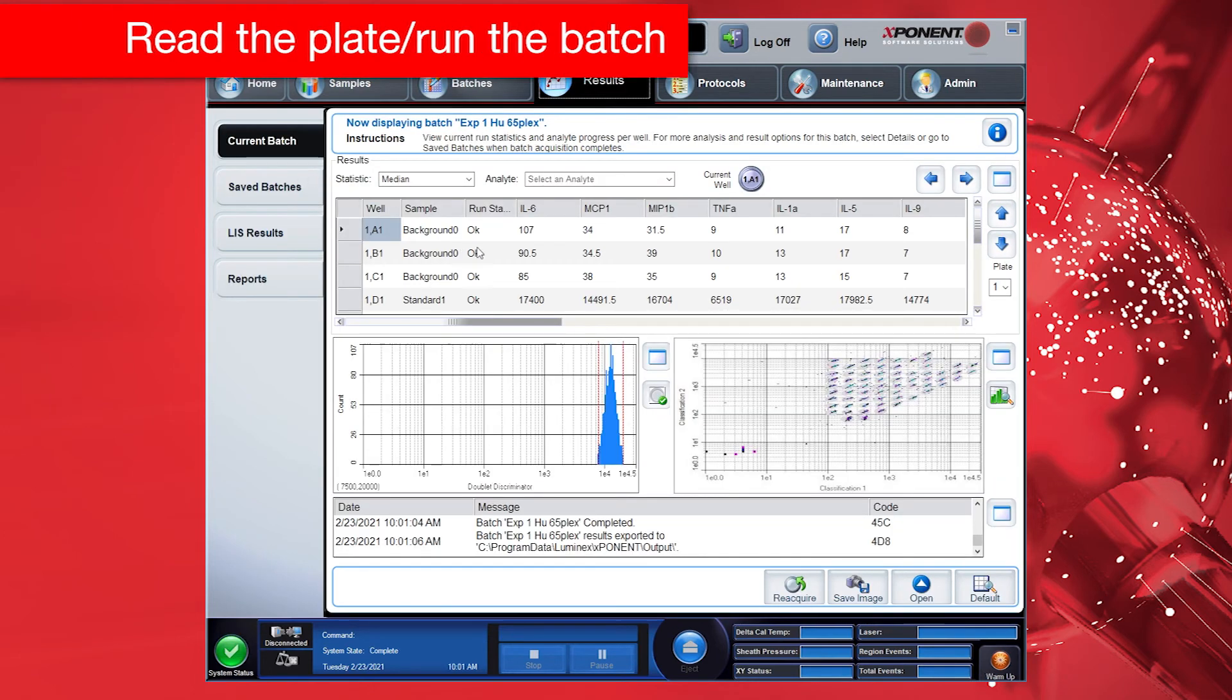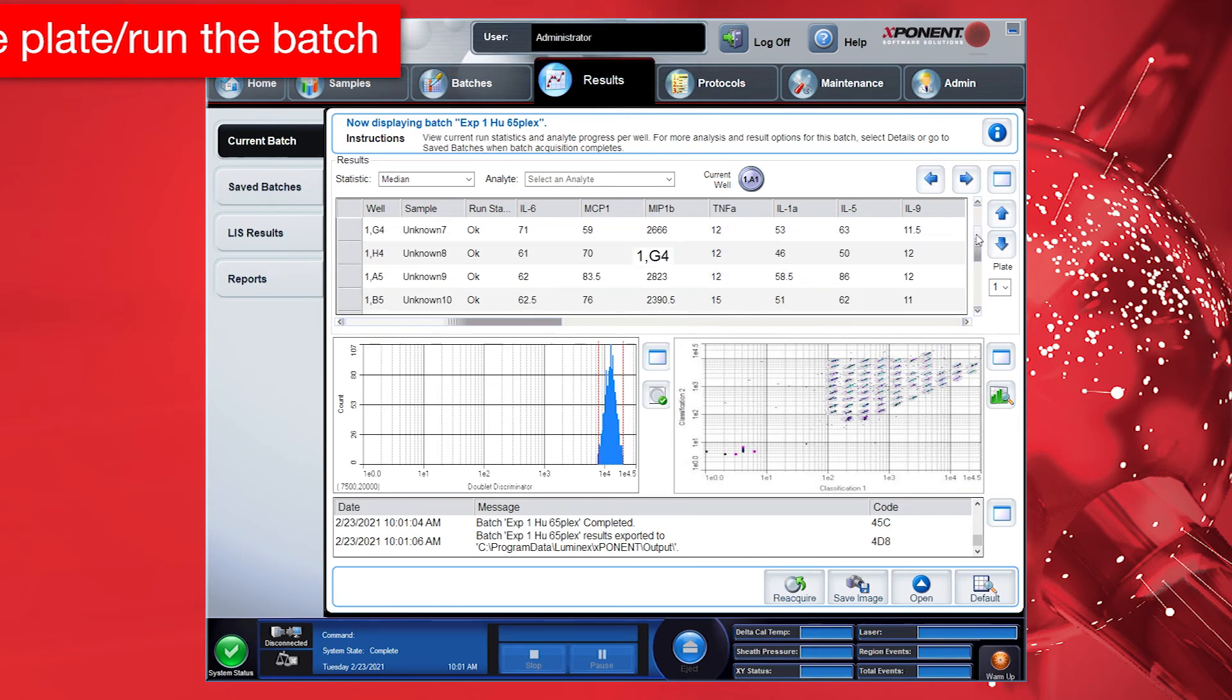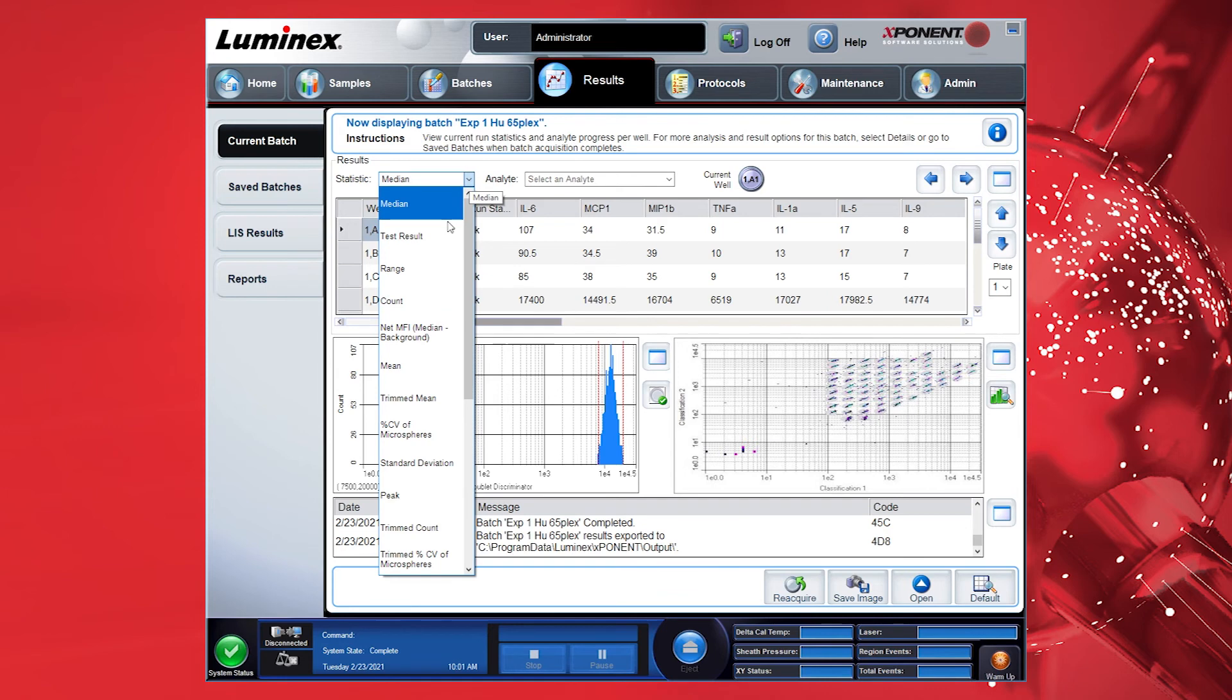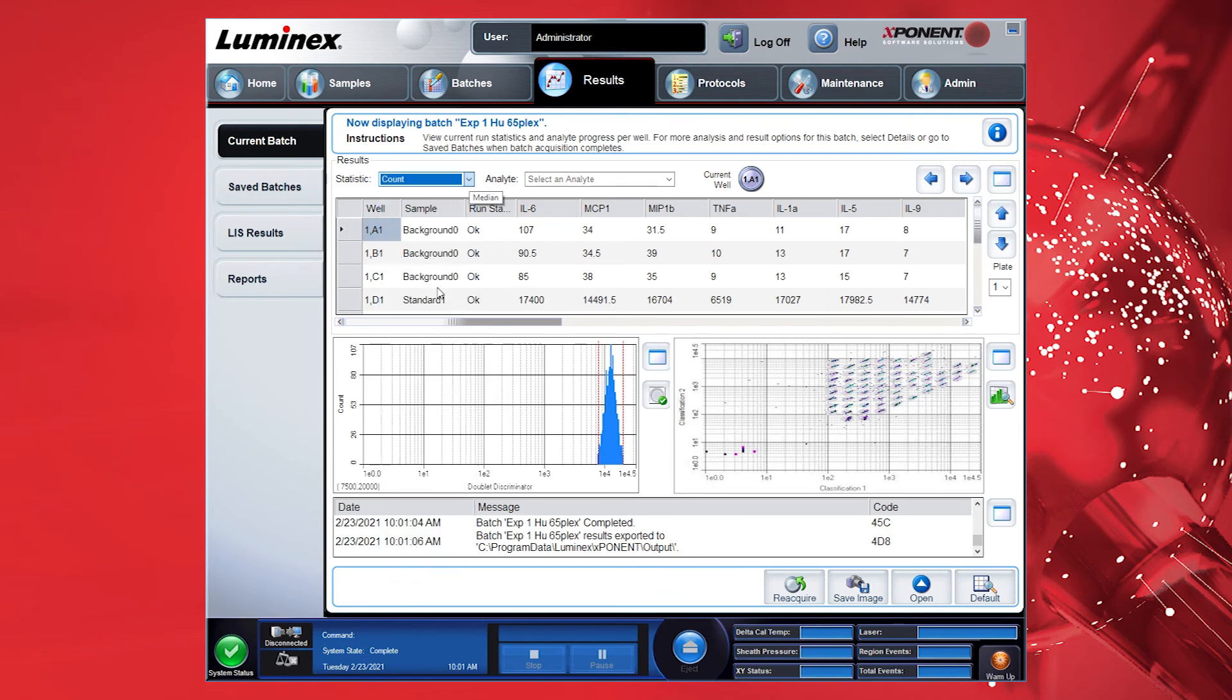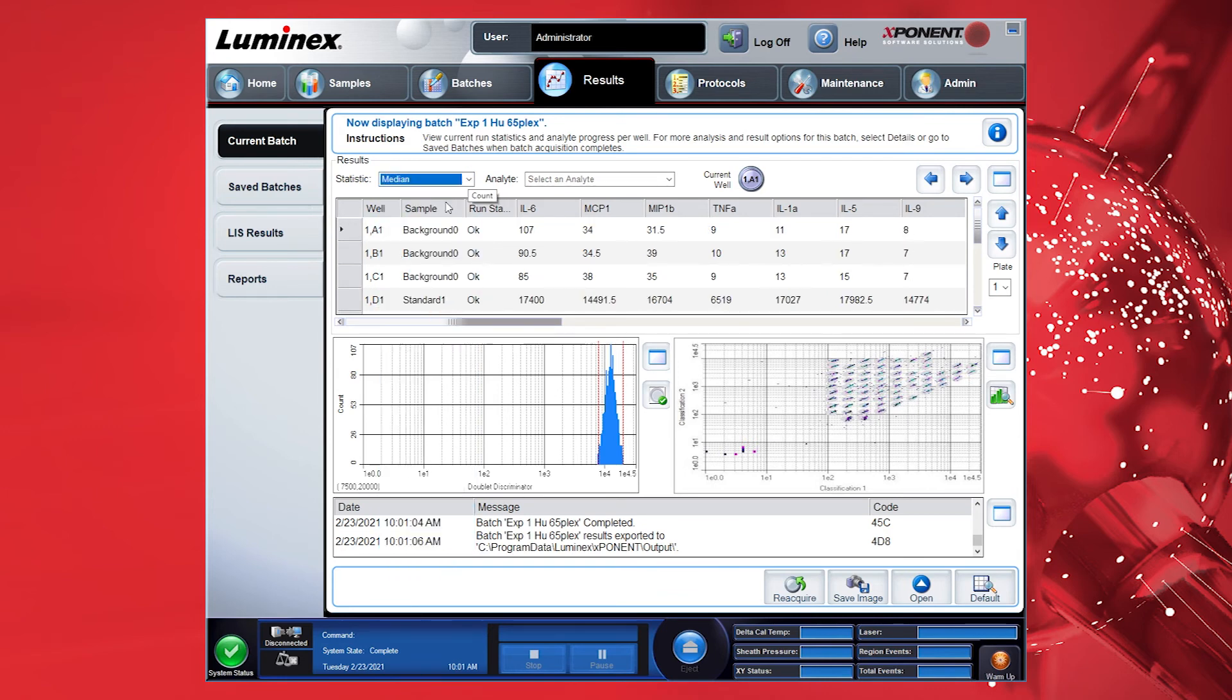During the Run in the Current Batch section in the Results tab, you can observe different parameters in real time by reviewing histograms, scatter plots, bead counts, and concentration values. For details on these parameters, refer to the Instrument User Guide.